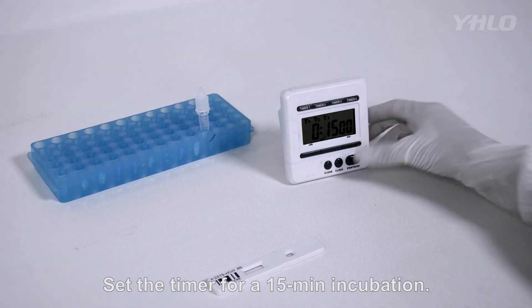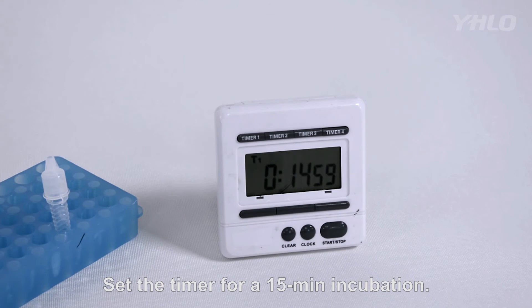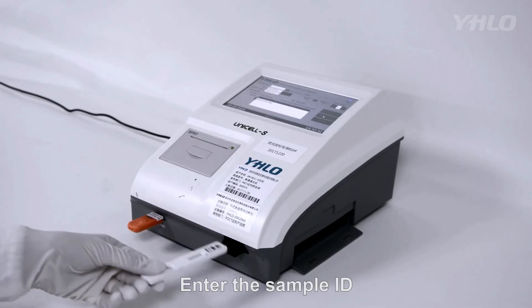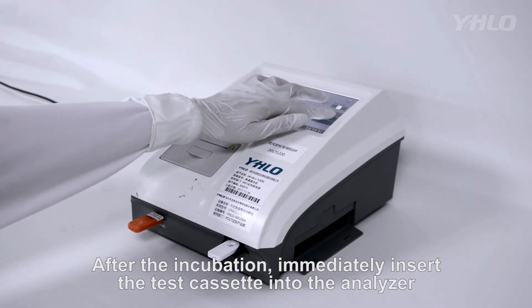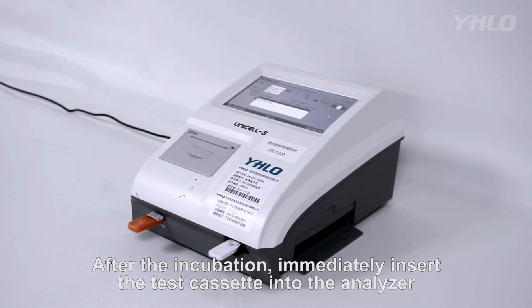Set the timer for 15-minute incubation. Enter the sample ID. After the incubation, immediately insert the test cassette into the analyzer.